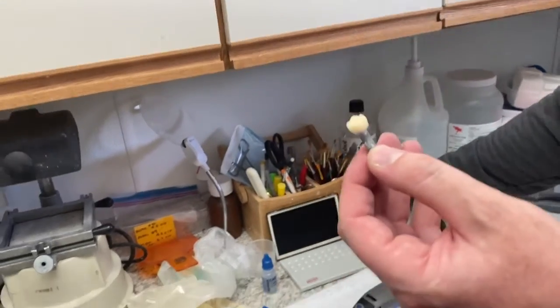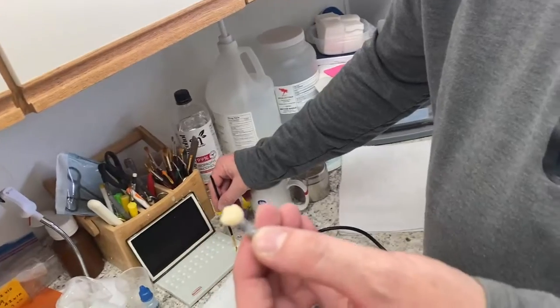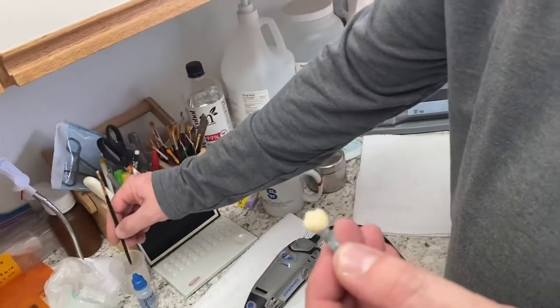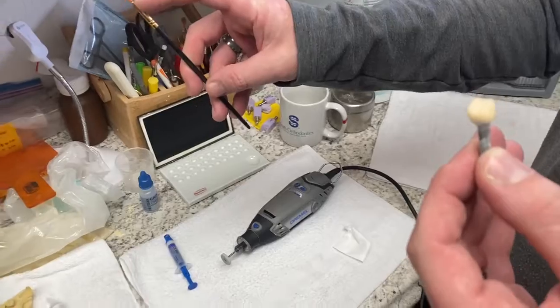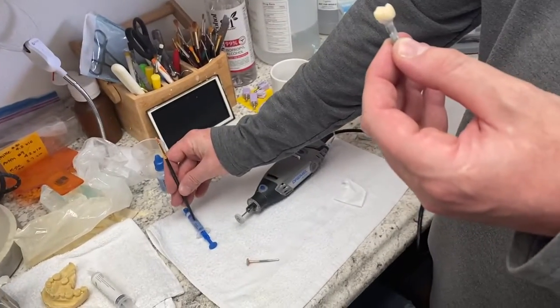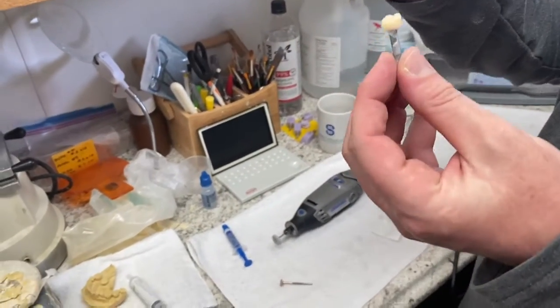Okay. So you just need a little bit on your brush. Where's the glaze? Right here. But when I need to refill that, you take 2 drops of the glaze liquid and about that brush length of the glaze putty. Okay. 2 drops and a brush length.